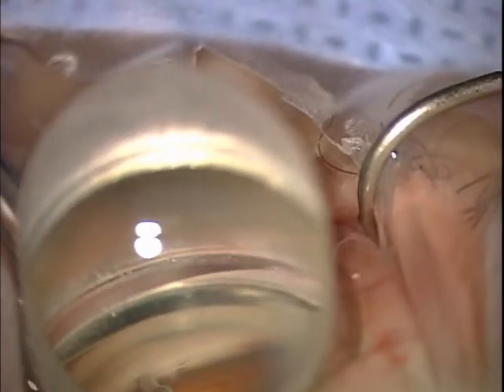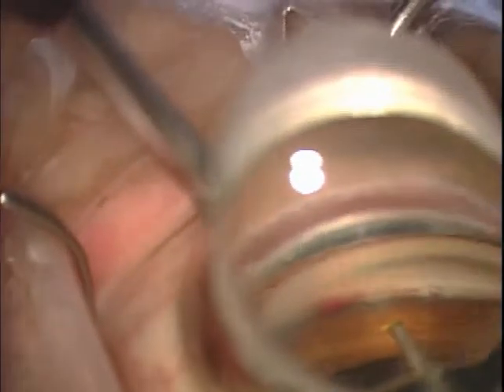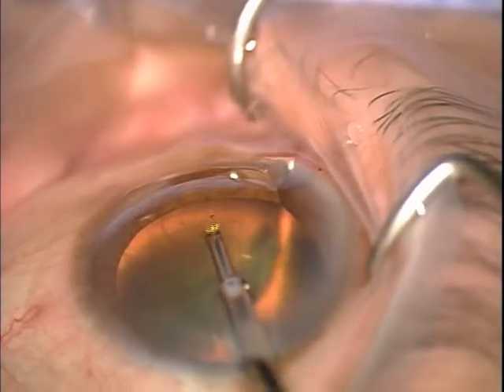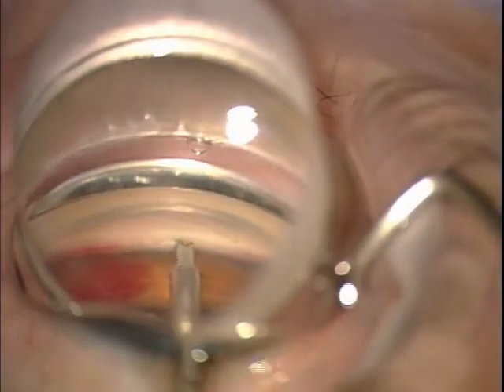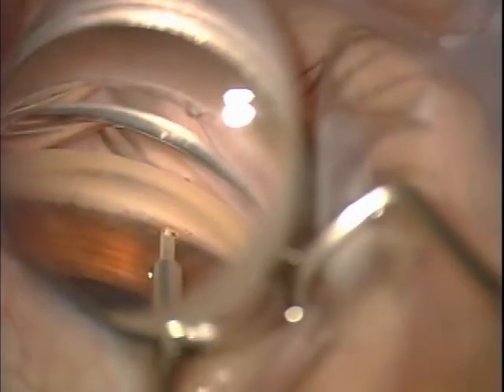Here you can see some reflux of blood from the opened cleft into Schlemm's canal. Following the initial pass, the handpiece is rotated 180 degrees. The trabecular meshwork ablation is then performed in the opposite direction. In this manner, approximately 90 degrees or 3 clock hours of trabecular meshwork ablation can be performed.